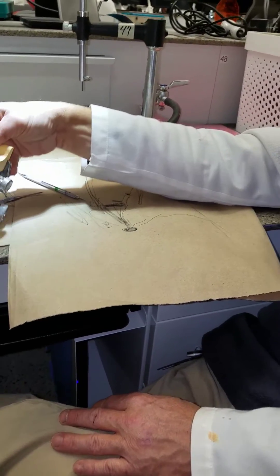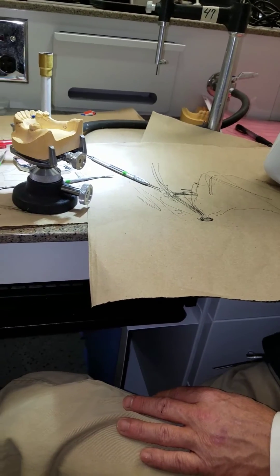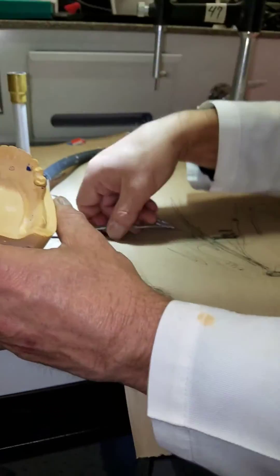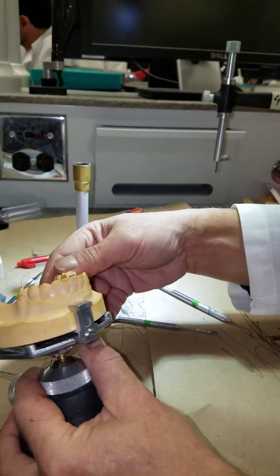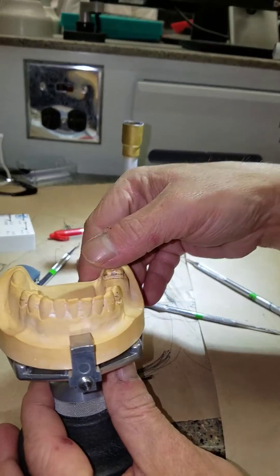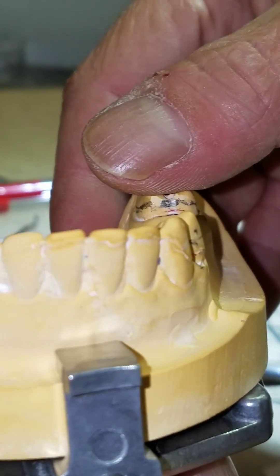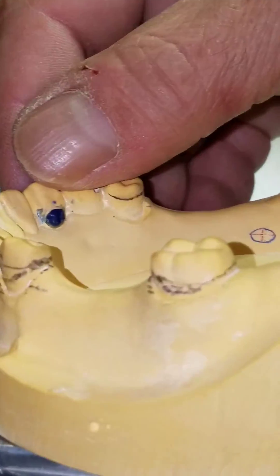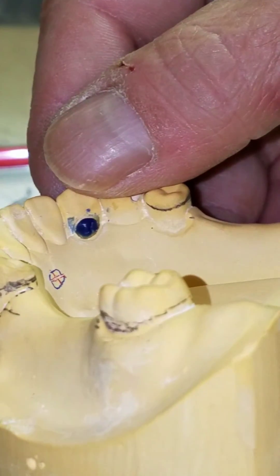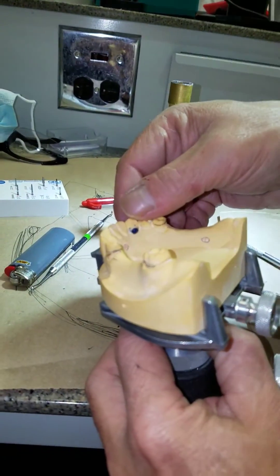Can you run through how you measured with your finger for the marginal ridge reduction? Literally just hold your finger there — you should see a very distinct reduction in that little marginal ridge. If I press hard, sure, I can make it disappear, so just hold it gingerly.